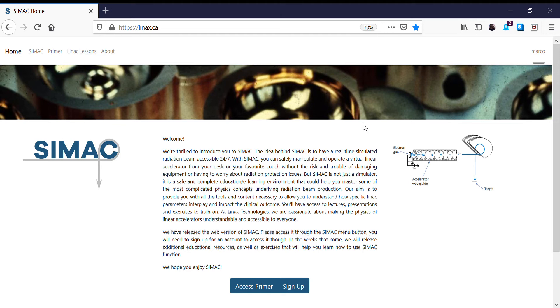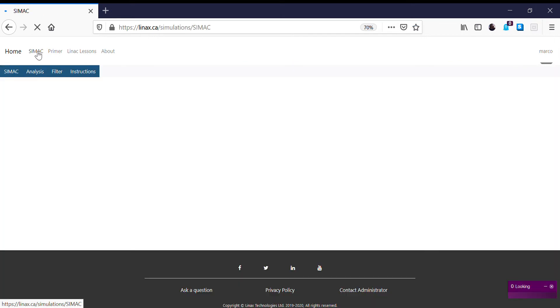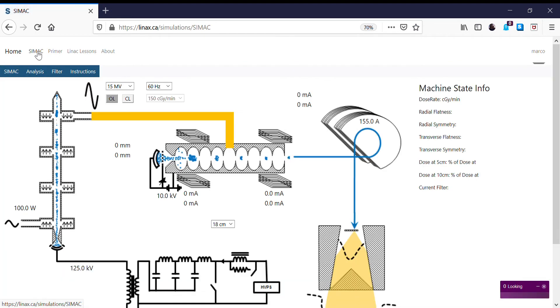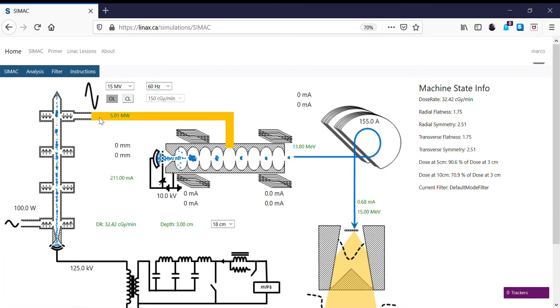We're going to now correct this by adjusting the bending magnet in order to match the energy coming from the accelerator and going towards target. So we'll pick up again where we left off, so we go back to our SIMAC screen. When we do this now, SIMAC remembers the parameters we had from last time, so it remembers the beam we had.